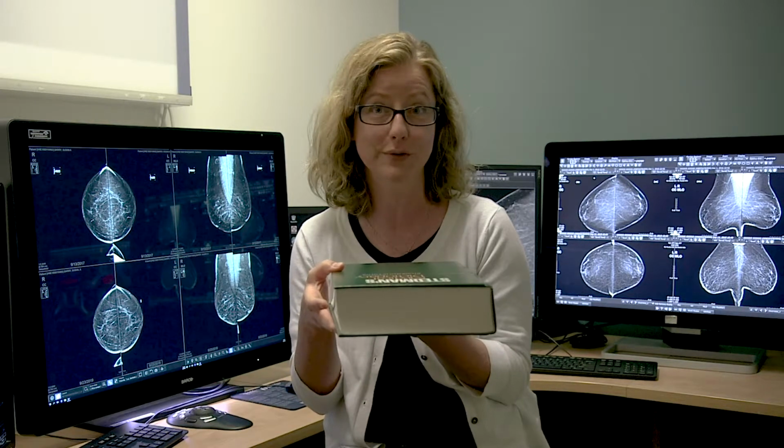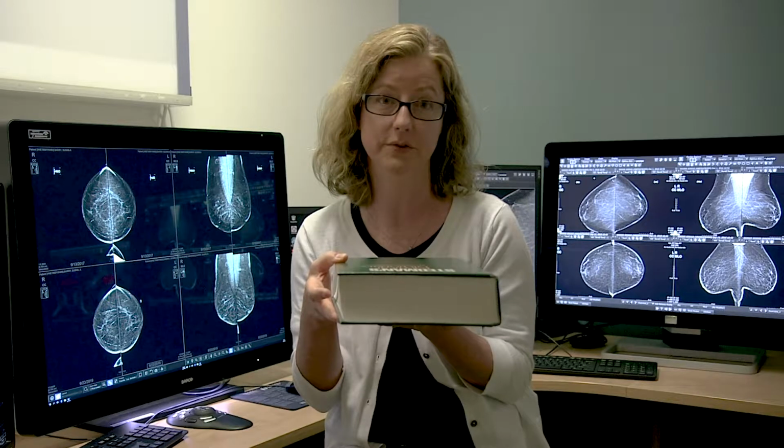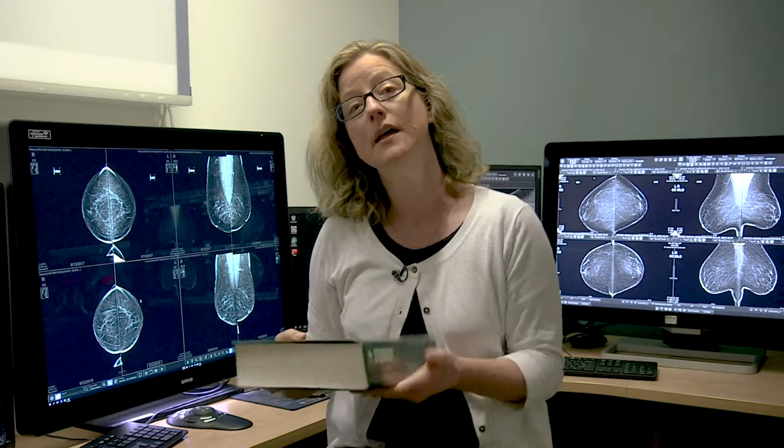A 2D or digital mammogram takes two views of each breast, and there can be a lot of overlapping fibroglandular tissue on those views that can hide a cancer. So how does a 3D mammogram work, and what's the difference? Well, from your perspective as a patient having the test, you'd hardly notice a difference. You still get compressed in the same two ways, from the top and from side to side for each breast.